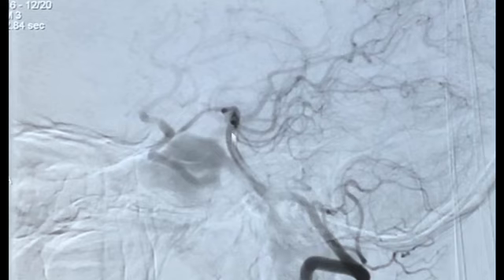This is the vertebral artery injection through the posterior communicating artery into the cavernous sinus, and because this is a very high flow fistula and the blood is getting sucked, so this is the site of the fistula.